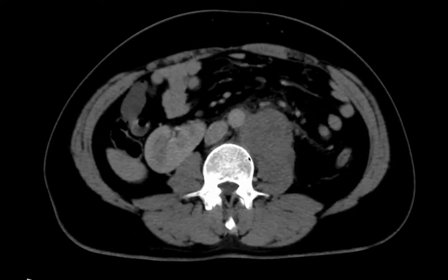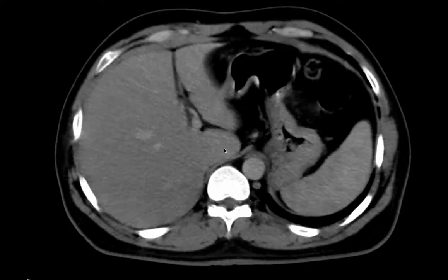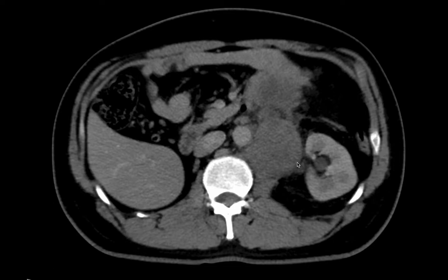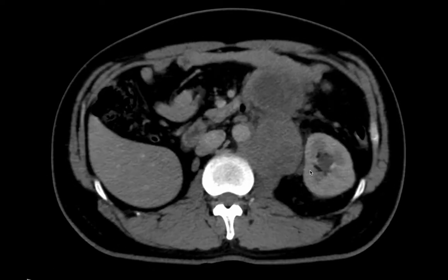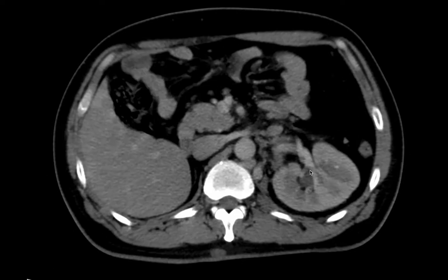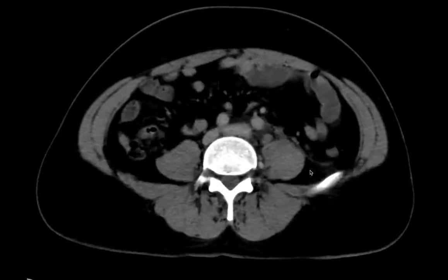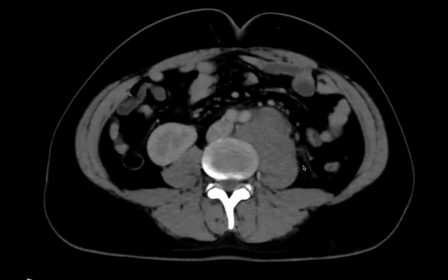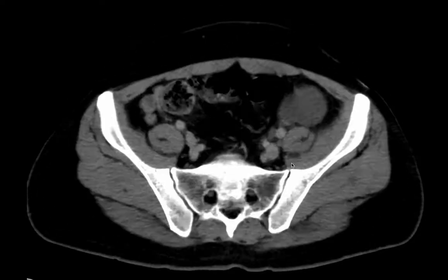The right kidney is mal-rotated in this section, coming inferiorly because of compression from the mass or lesions on the ureter. There is mild pelvicalyceal system dilatation on the left side. The ureter is posteriorly related to the mass and anteriorly related to the psoas muscle.